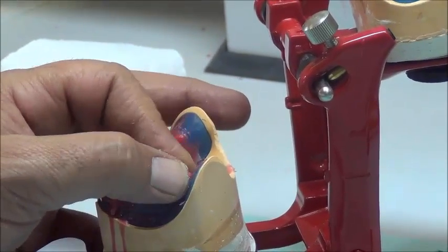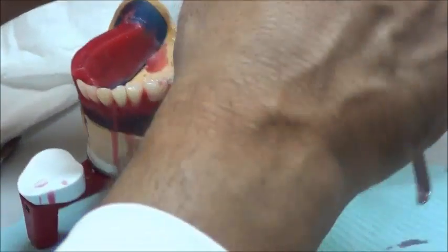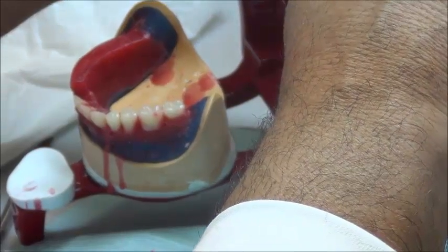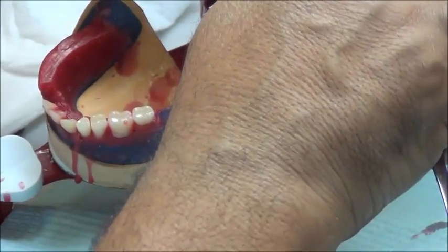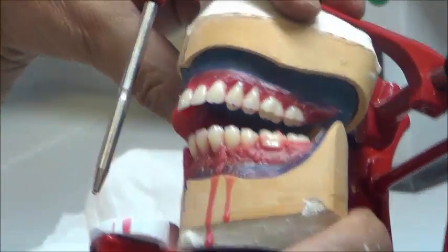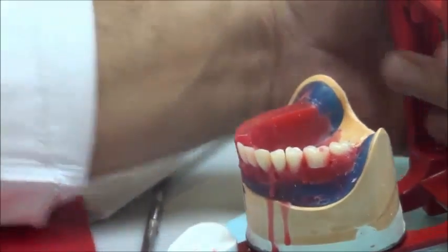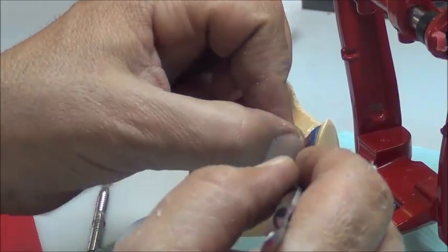So if the tooth is touching the base plate, let's follow the rules that we have done for teeth that don't have space, and that is trimming from the wax first, and then trimming from the base plate, and then trimming from the tooth itself. Okay. Before closing, we just made sure that the upper wax, no wax is present extra. And now the tooth goes into contact with the upper 7. And once we finalize it, we go lingually and fit it into place.